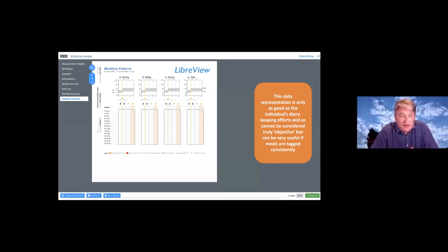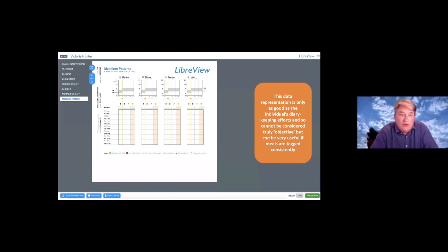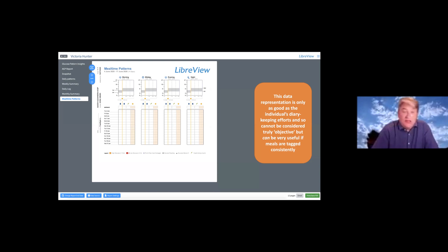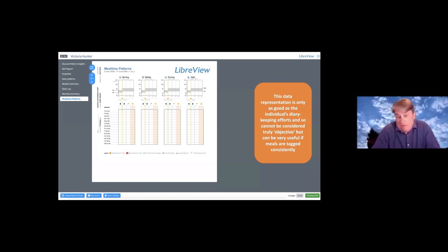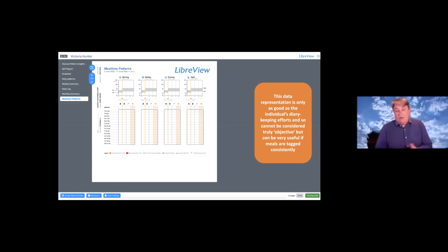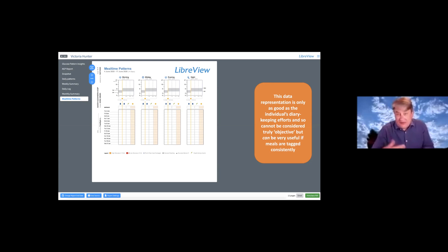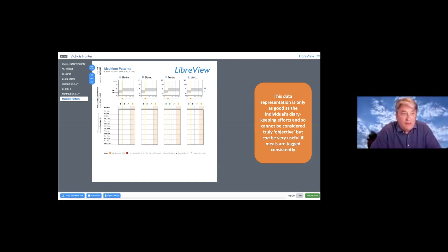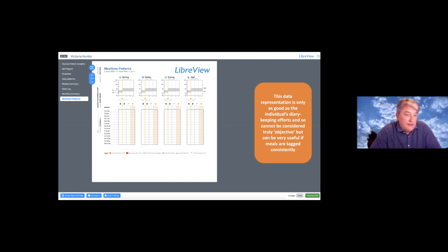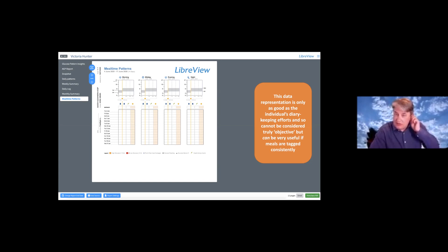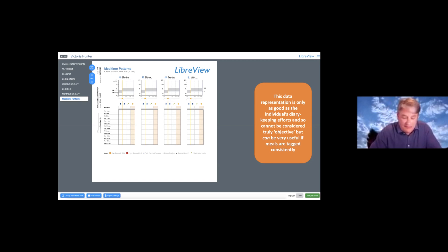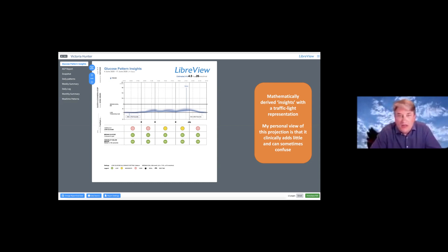There is a mealtime patterns screen present in lots of CGM data presentations, and for most people it doesn't show very much unless they're really good at logging their meal times, carb intake, and insulin doses. When people are good at logging it can be a really useful screen. From my perspective, most people log effectively when they're actually using the data in a bolus calculator as they go along — which means the data gets entered and we get this mealtime patterns view. At the moment the bolus calculator within the software isn't available for LibreView data on its own, so if they are logging it they'll be doing so in a third-party app.